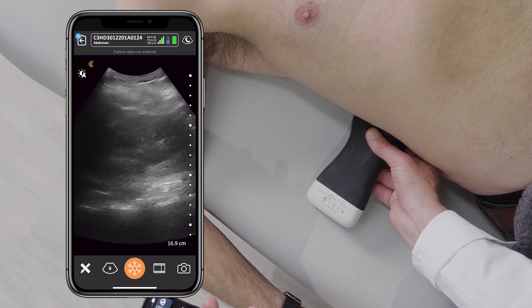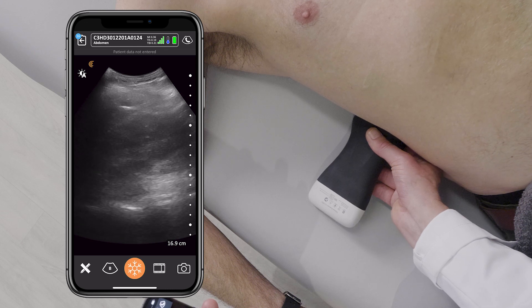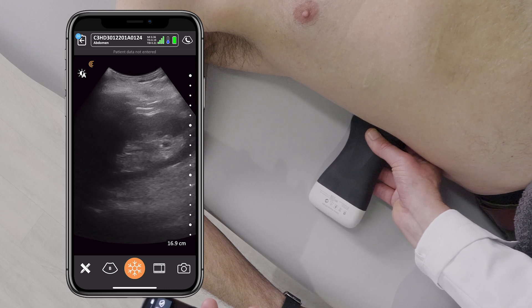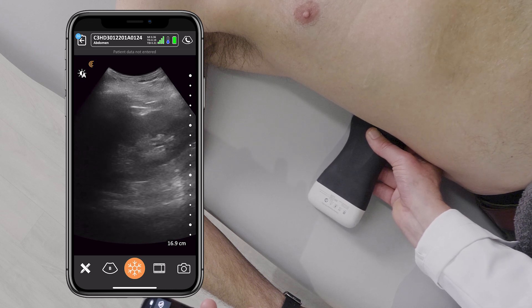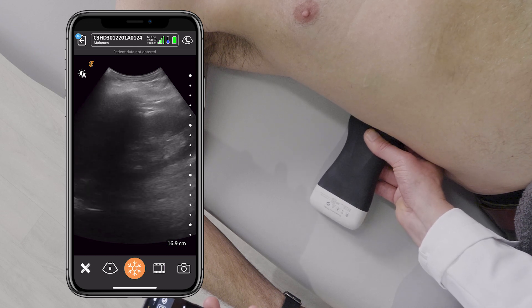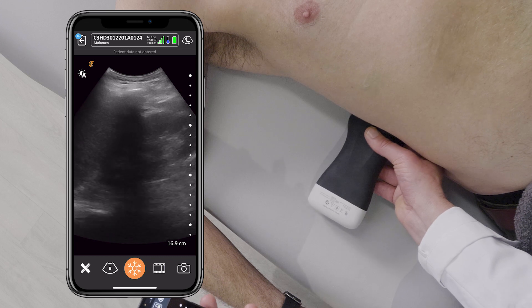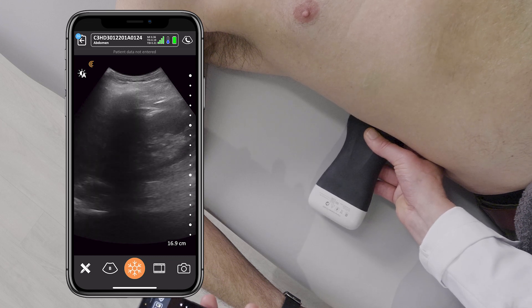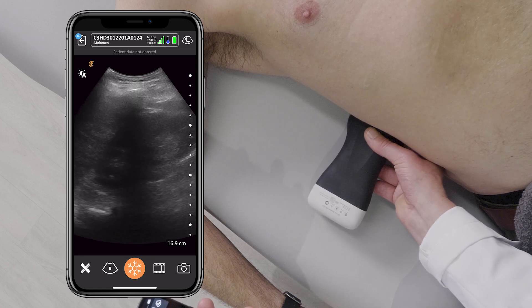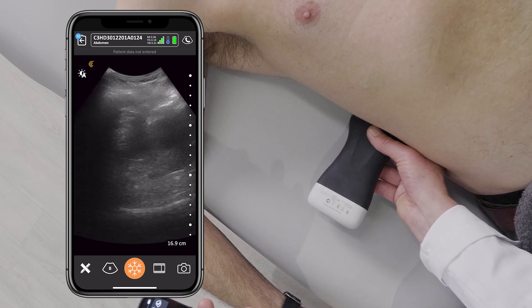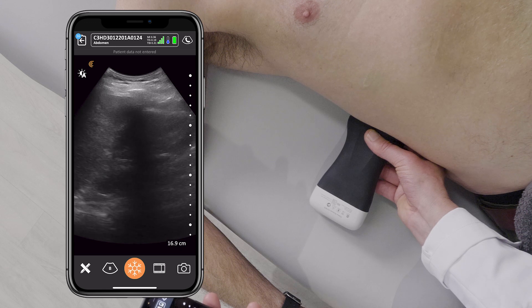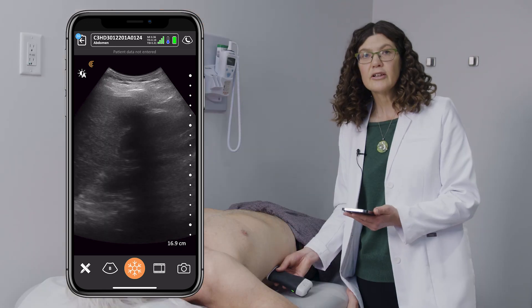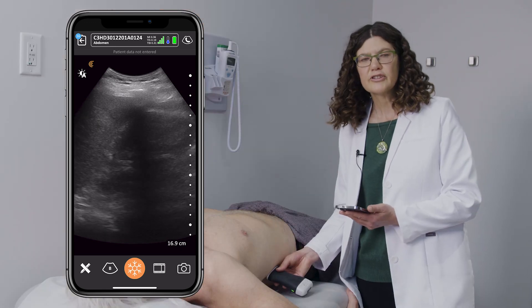Alternatively, you can move down a rib space, as I've done here, and continue your sweep. You want to assess the kidney all the way from anterior to posterior. This concludes the kidney ultrasound exam.